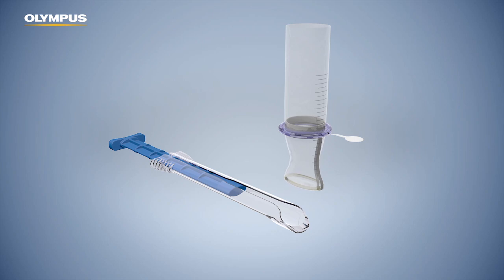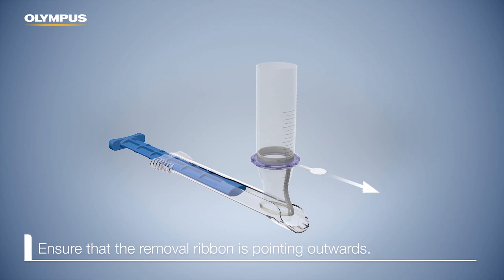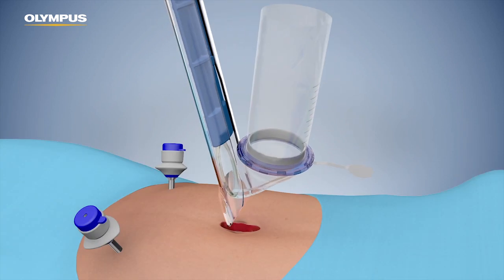Insert the distal ring into the introducer with the removal ribbon at the distal end. Ensure that the removal ribbon is pointing outwards. Avoid bunching of the sleeve. Guide the retractor introducer through the incision.